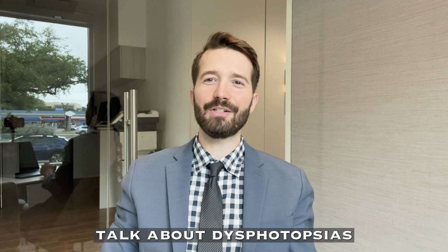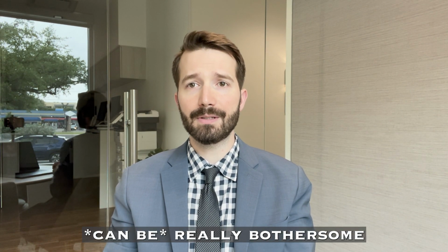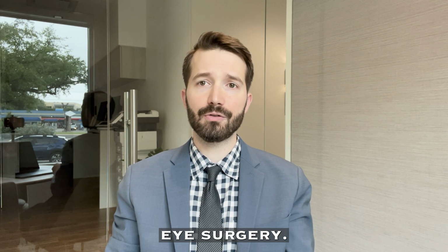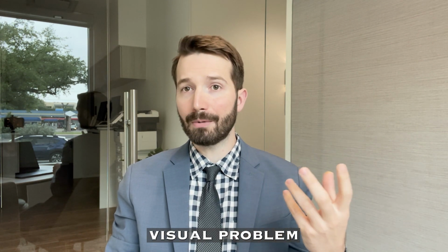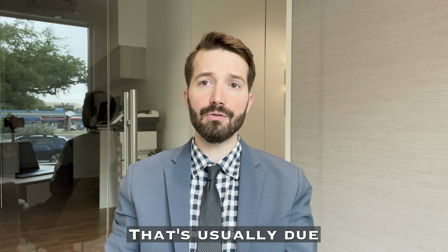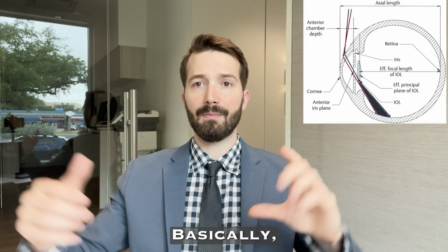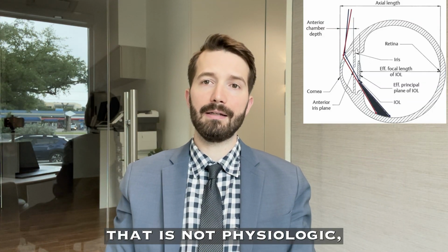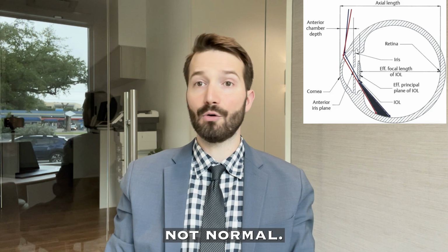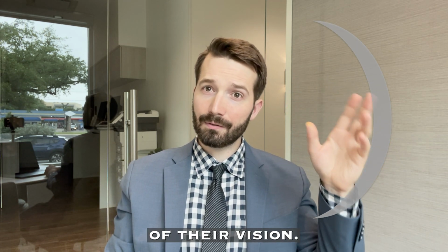Hey guys, today I want to talk about dysphotopsias. Dysphotopsias are really bothersome for patients after cataract eye surgery. A dysphotopsia is an unwanted visual problem or phenomenon that's usually due to the design of the intraocular lens itself. Basically, the light comes in, catches the lens, and scatters in a way that is not physiologic, not normal. As a result, people have funny visual phenomenon, usually on the edge of their vision.